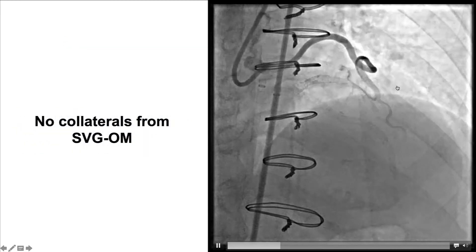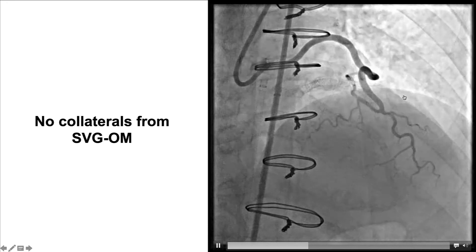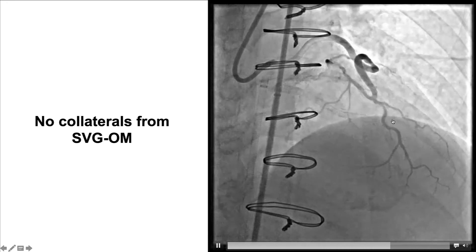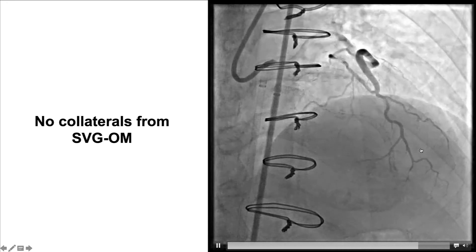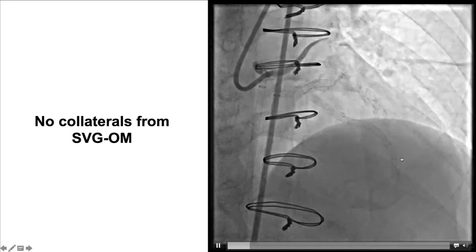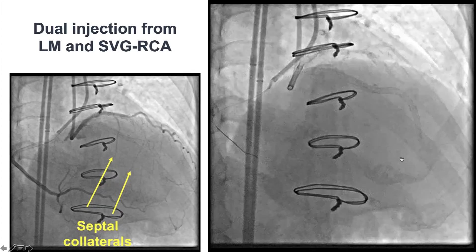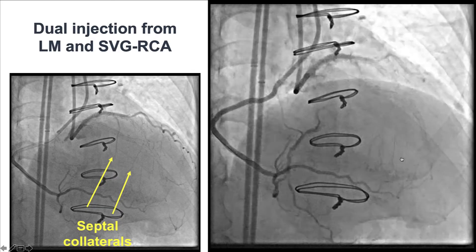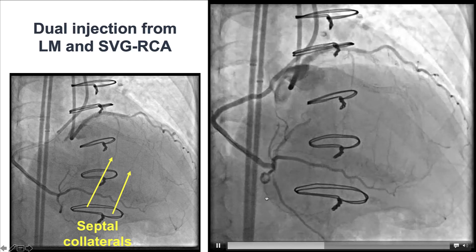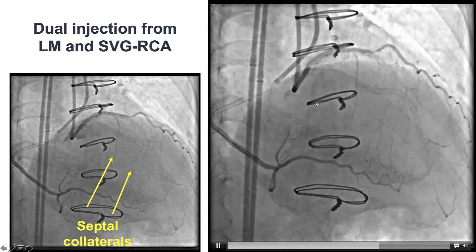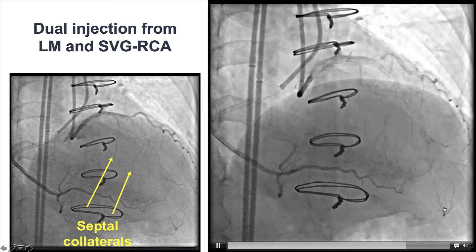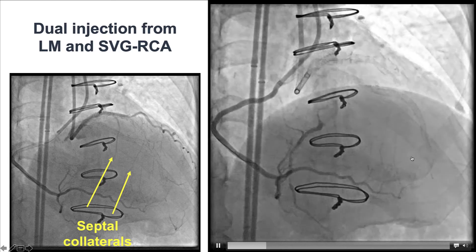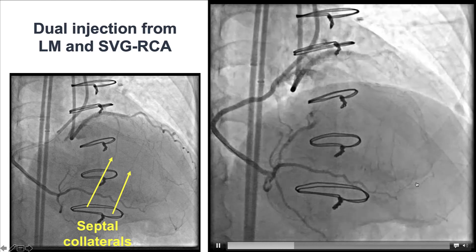We injected another vein graft supplying the obtuse marginal, which was patent without any lesions. However, there were no collaterals going to the LAD. We also performed a dual injection injecting the saphenous vein graft to the posterior descending artery, which demonstrated some filling of the distal LAD through septal collaterals.